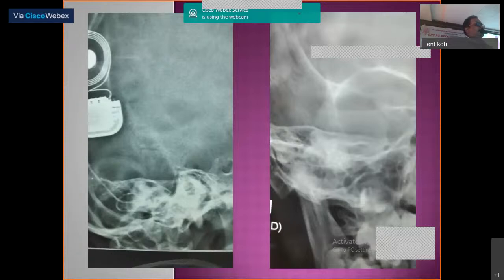And we were all celebrating that we had done it successfully, and cake, pastries, and everything had come. So we switched on, and we came to know that the implant was not working. So we took an X-ray. You see the electrodes here, they're in a straight line going into the eustachian tube. So we redid the surgery, removed the electrodes, put them back into the cochlea, and took the post-operative X-ray. You see nicely the electrodes are now coiled inside the cochlea. So plain X-rays may be useful even for cochlear implantation, post-operatively, to evaluate the placement of the electrode.